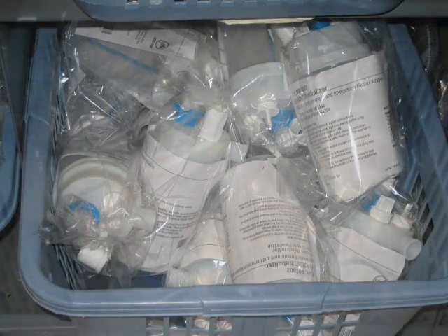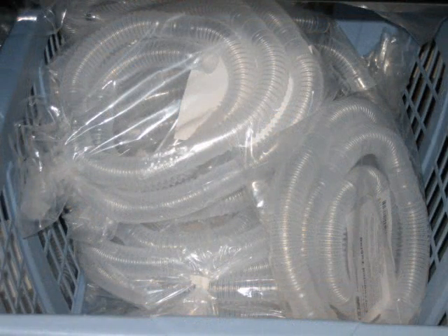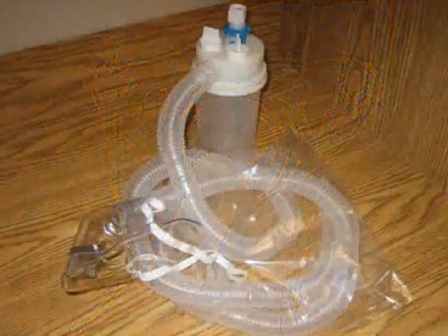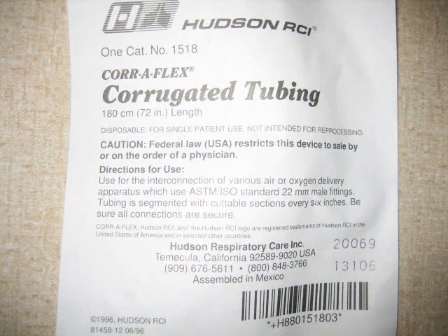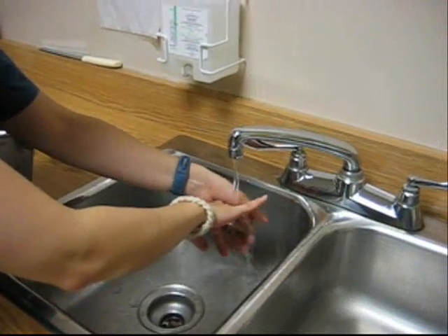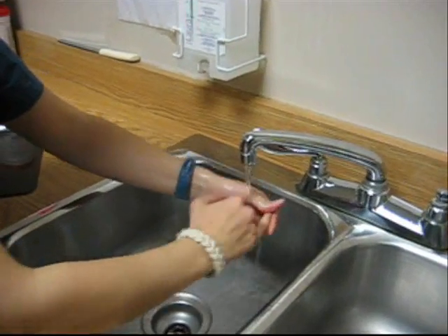Verify, interpret, and evaluate the physician's order for appropriateness. Select, gather, and assemble equipment. Test all equipment according to the manufacturer's specifications that may be listed in the product monograph of the packaging. Use professionalism and aseptic technique throughout the procedure.